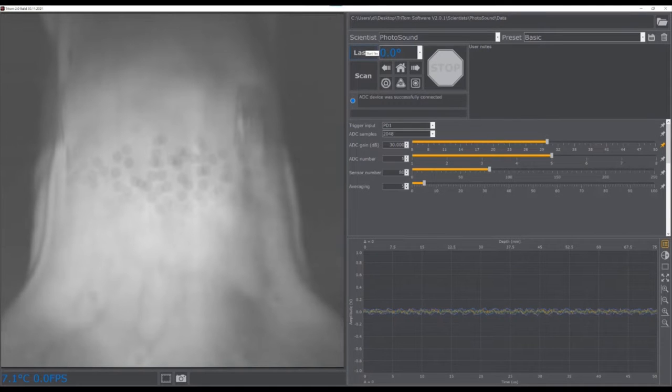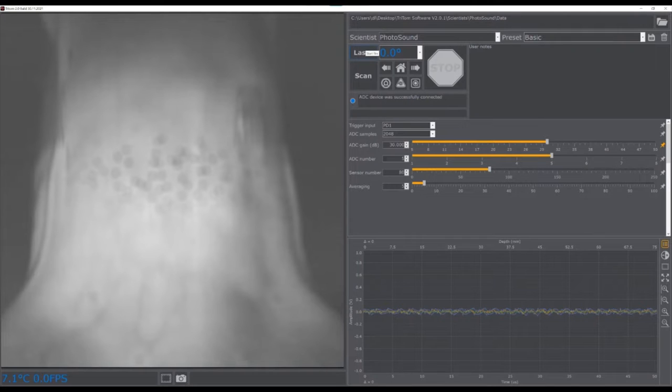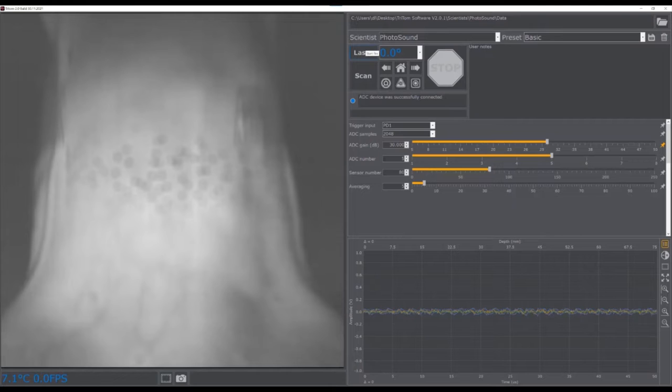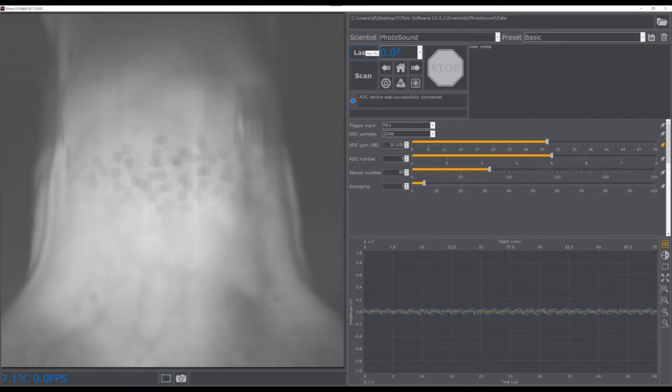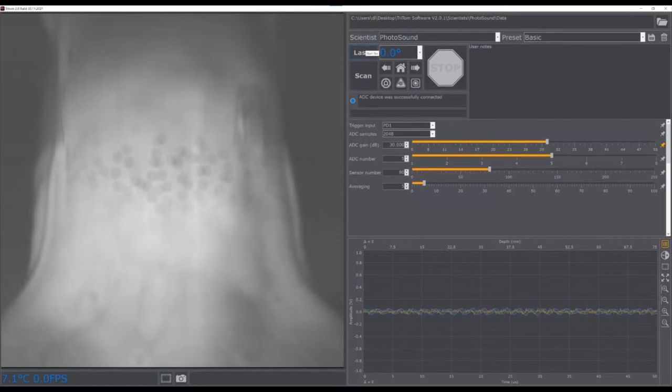Averaging can also be applied to all plot lines on the photoacoustic viewer to reduce noise and improve visualization of the acquired photoacoustic signals. It is important to note that averaging is not applied to the saved scan data and is not incorporated into the ADC signal and saturation warning.